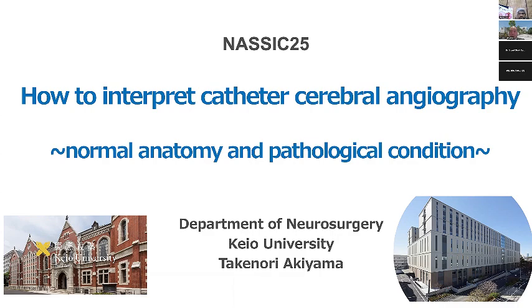Attending the session. I'm going to talk about how to interpret catheter angiography with a focus on normal anatomy and various pathological conditions.